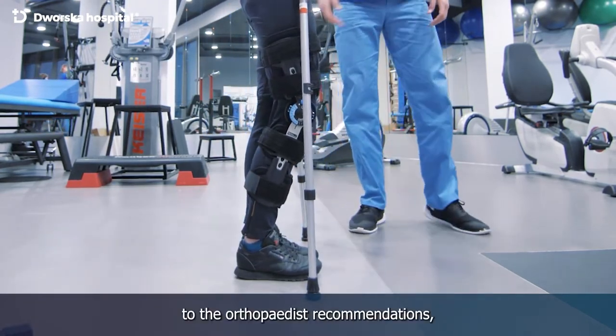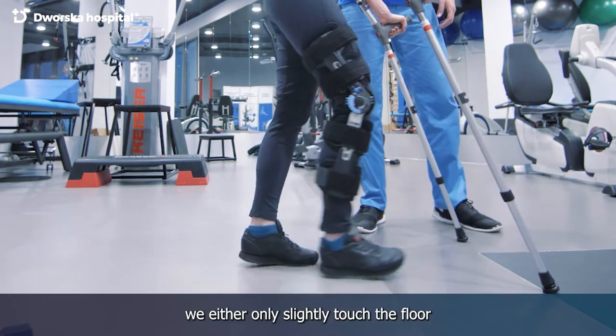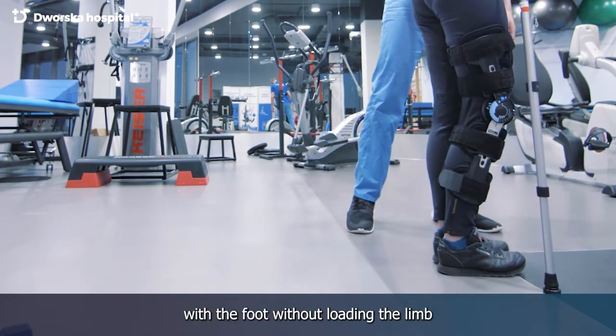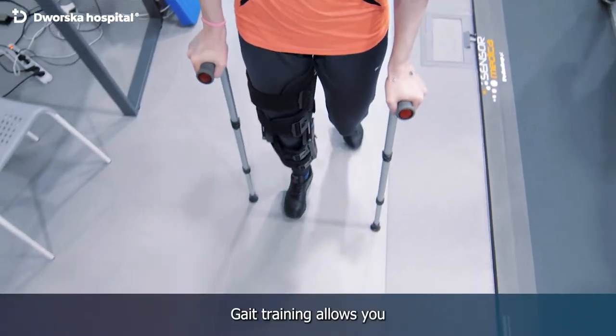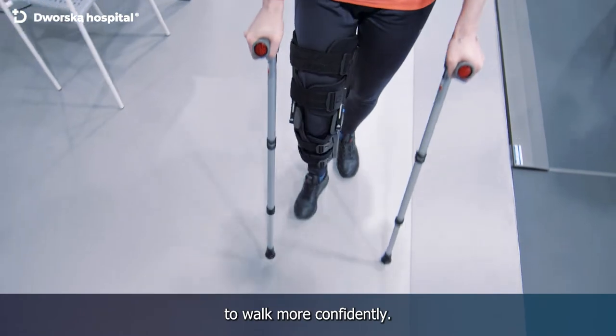According to the orthopedist's recommendations, we either only slightly touch the floor with the foot without loading the limb, or we load it partially. Gait training allows you to walk more confidently.